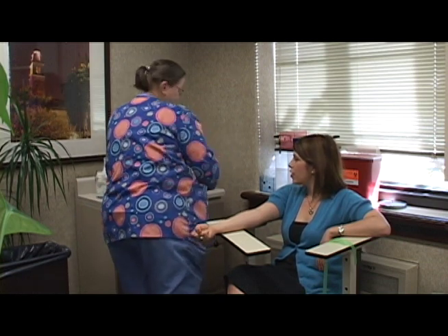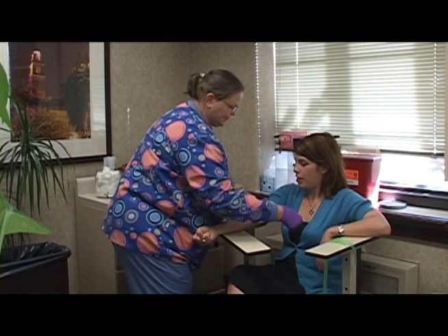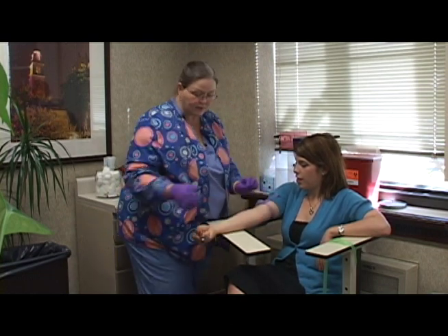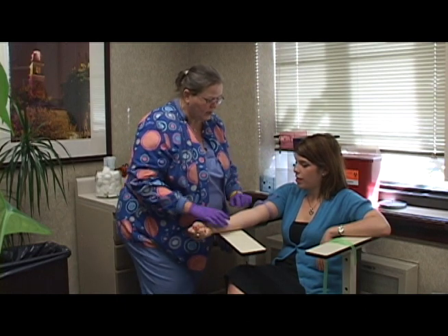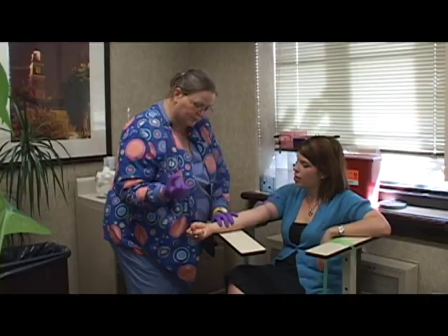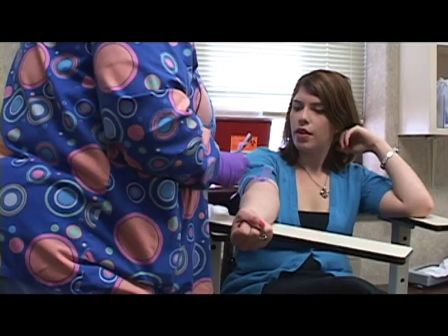We apply a tourniquet. Then you're going to squeeze, which you already are, and we actually palpate for a vein. Okay. Squeeze your hand a few times for me. Hold, right there.